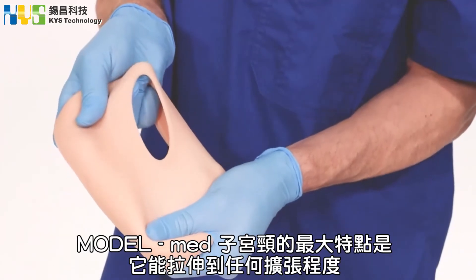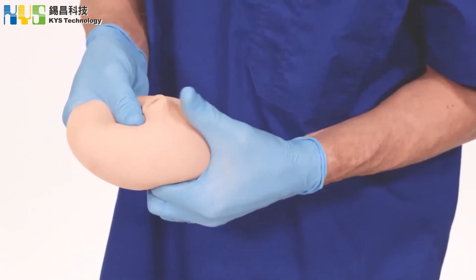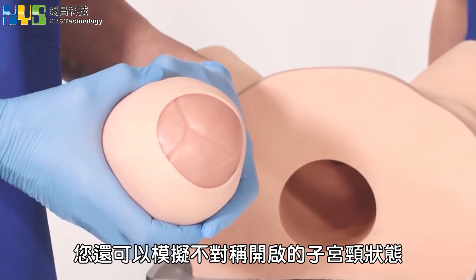One of the real advantages of the ModelMed cervix is that it can be stretched to any size dilation. You can also simulate an asynclitic cervix, which is not symmetrically open.